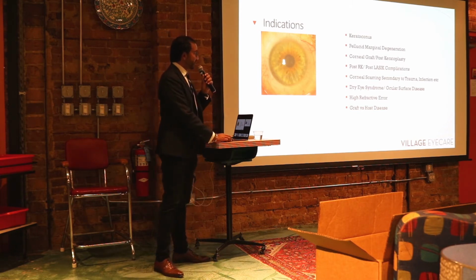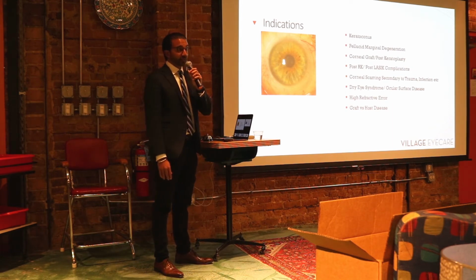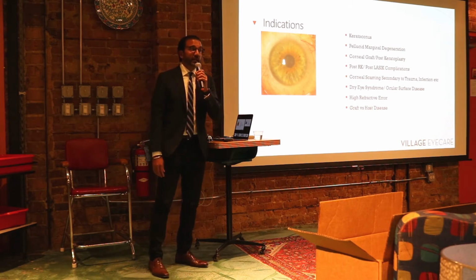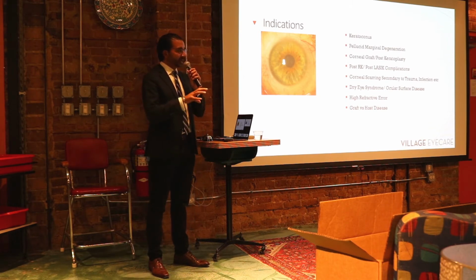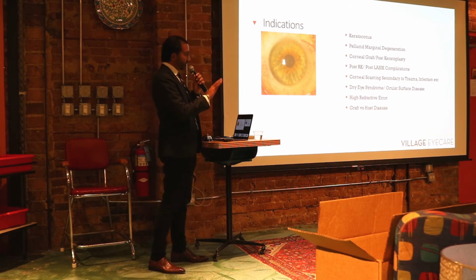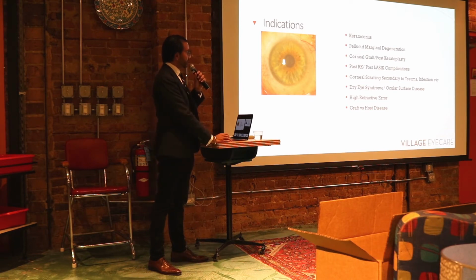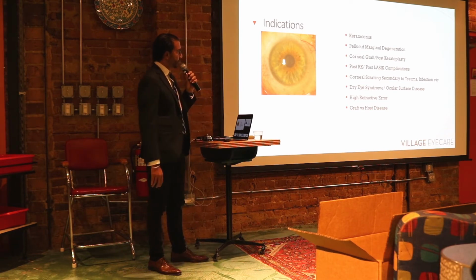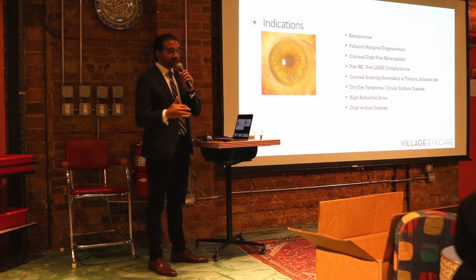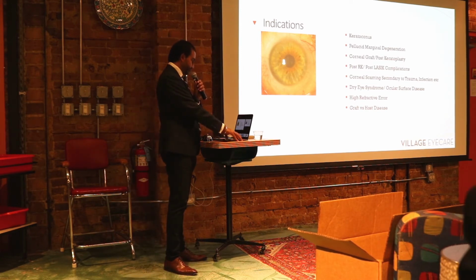High refractive error is another one. High myopia, a large amount of astigmatism. Patients see really well. Again, it's a gas-permeable material, so we know how effective they are at improving vision. But the stability that you get with the scleral lens and that material makes it very effective. Even with a regular cornea with a high amount of myopia, I have patients that prefer the vision through scleral lenses over their soft lenses. Graft versus host disease, again, that's where the corneal surface really dries out, and scleral lenses can make a huge difference. There are a number of other conditions where those patients are great candidates for sclerals.